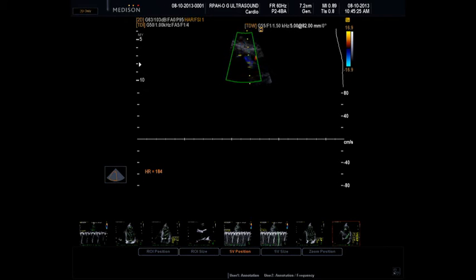And so basically you've got the mitral valve annulus and you're having a look at the movement. When the heart contracts, you've got to think that the apex of the heart remains still and it's the base that twists and descends down towards the apex. So there's a twisting movement from the base towards the apex.